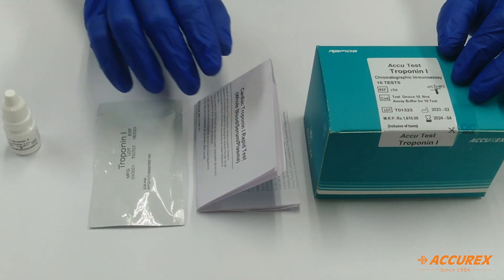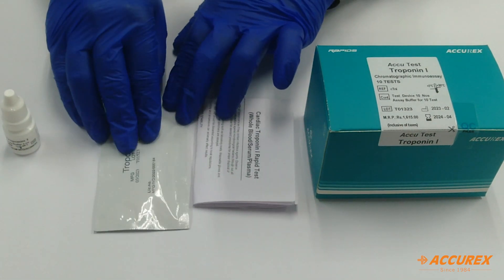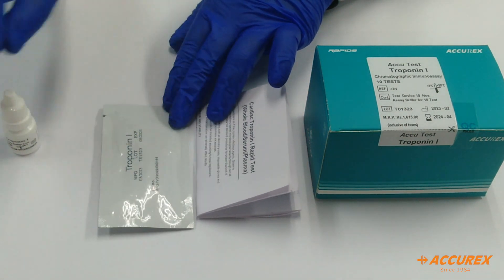Components inside the kit: You will find one package insert, one pouch containing Troponin I test card. Inside the pouch, you will find one dropper and one buffer.